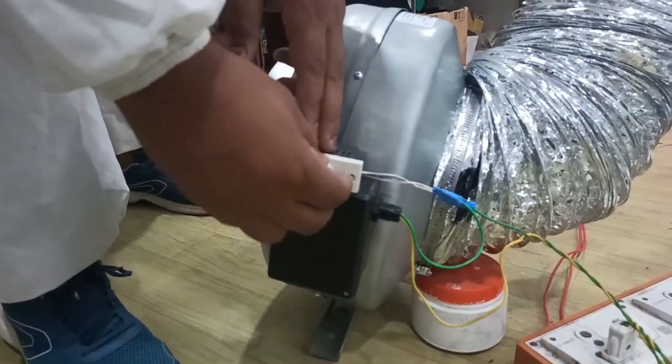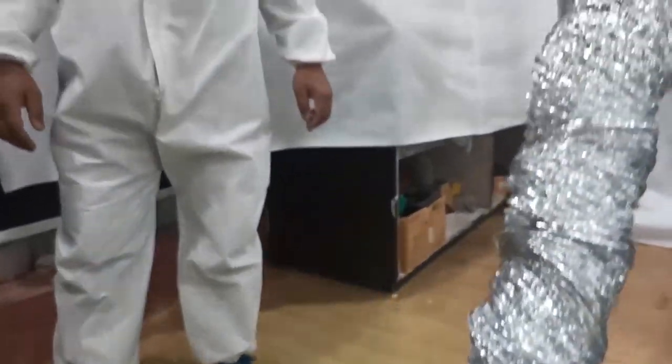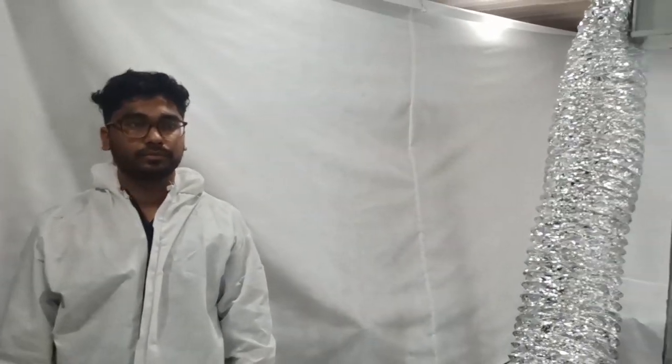I hope you have understood the features and benefits of this portable isolation room and how it can help your infrastructure to be scaled up.